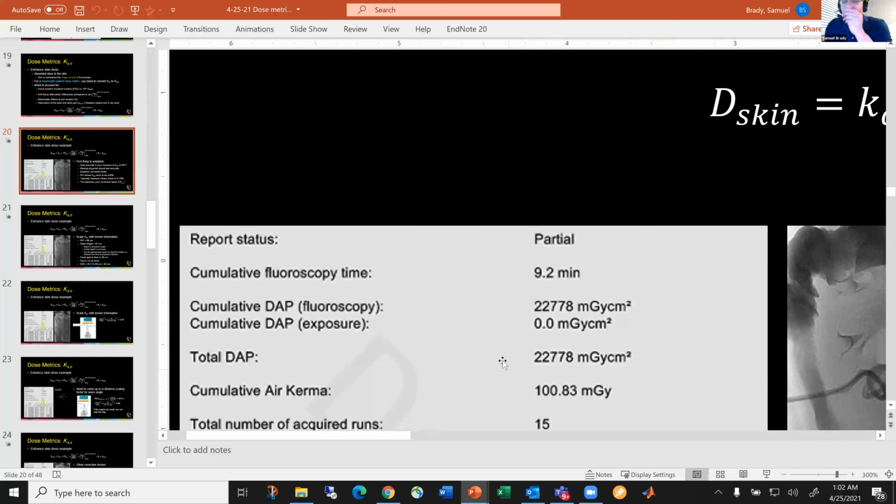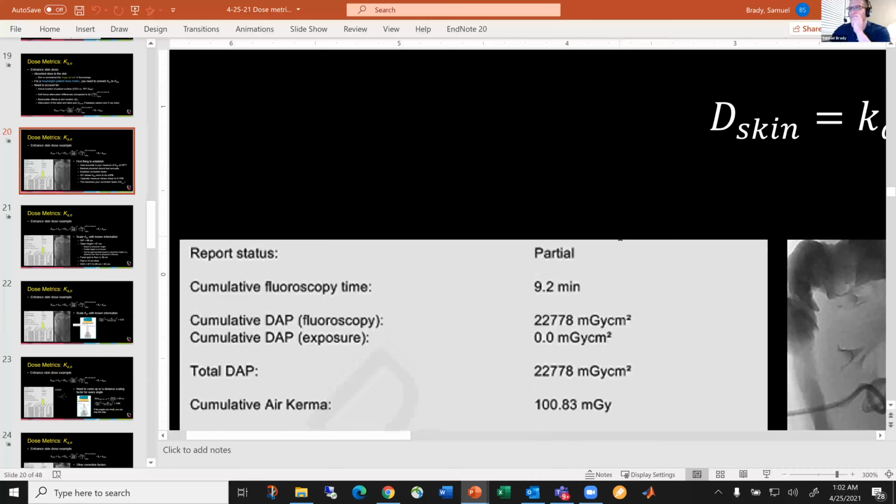I see. So the next question is about the dental cone beam CT. Do we also check the dose reading? You'll never get high enough on a dental. The dental cone beam will still have the same air kerma and KAP, or DAP, but by way of tissue effect, it's not an issue.